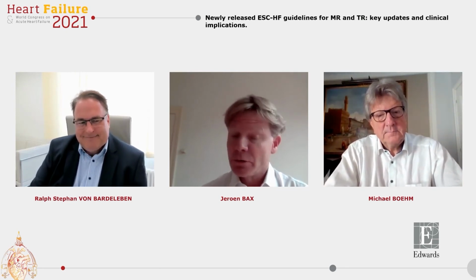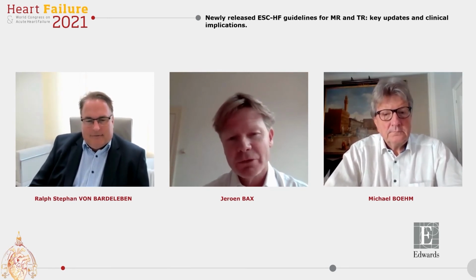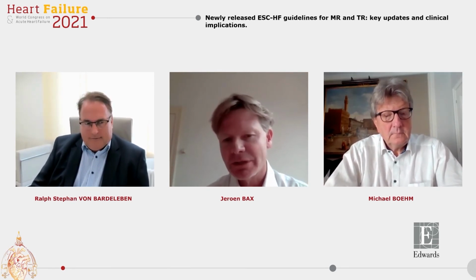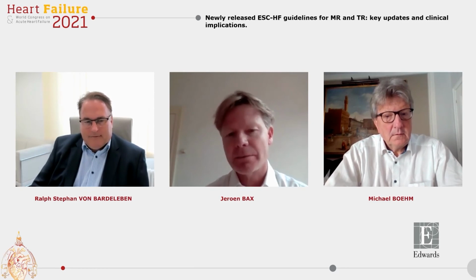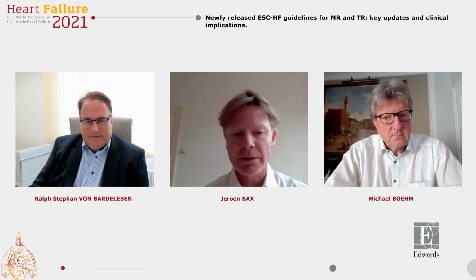Yeah, I think this is a very good point that we need to focus on both valves. But I also like what you put forward, which is the staging. This transcatheter approach gives us the possibility to first evaluate the response to this, and then we shift to the other one.